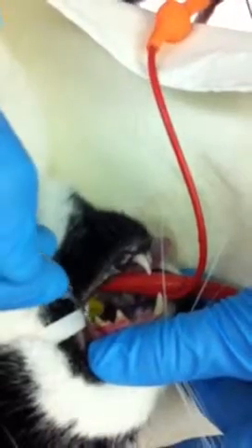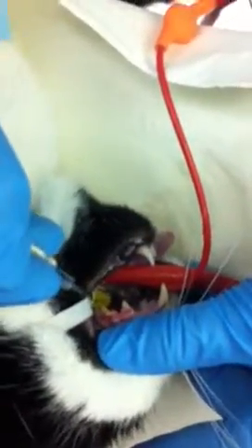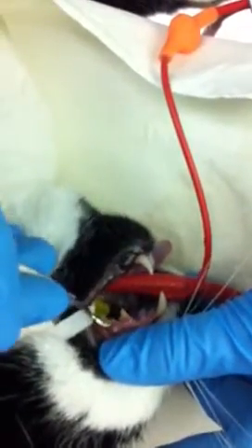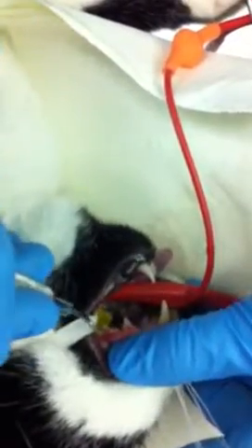You just want to go just above the gum line and take down in a nice swift motion. You don't need to use excessive force — just little bits at a time to get that plaque and tartar off.